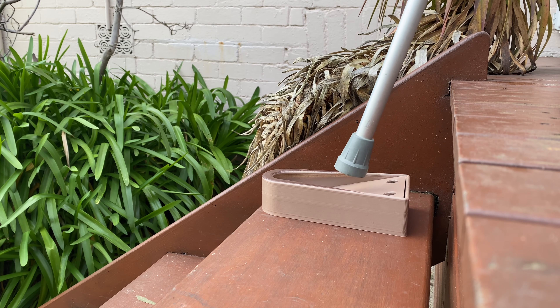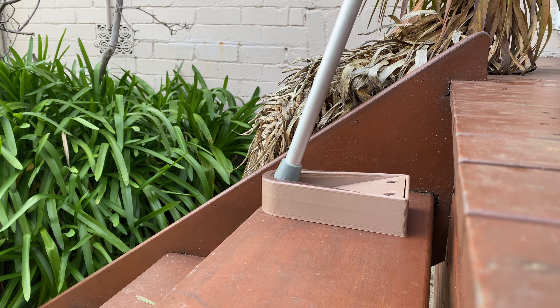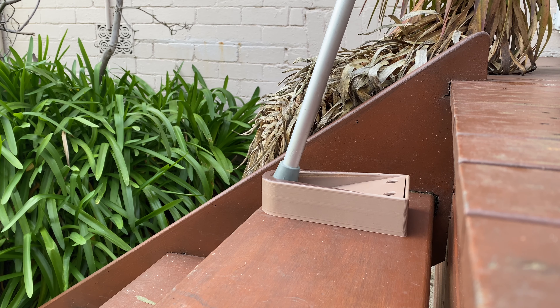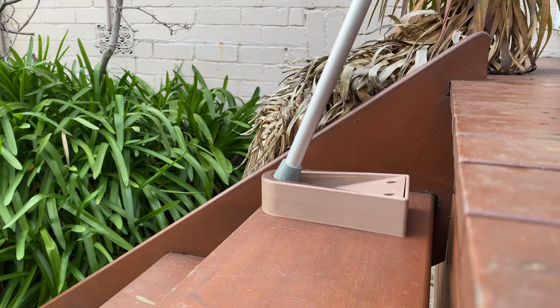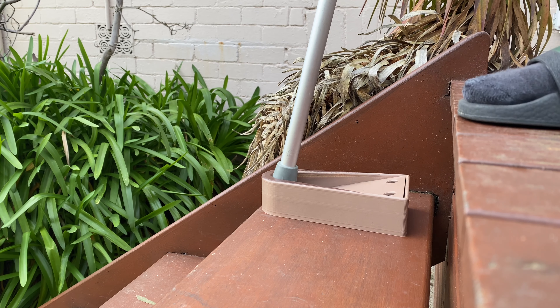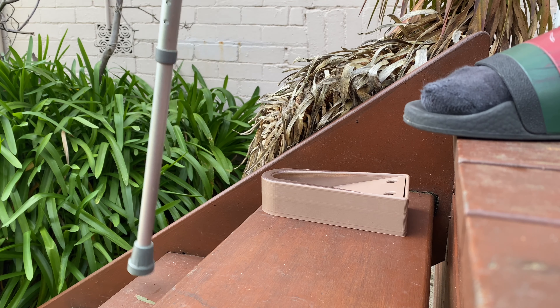With the ramp inside and the device in place, the user is able to descend and just aim for the ramp, slide on down, and the nice glossy surface lets it slide in. It'll just lock in place at the end, held under the lip, and the user is able to put all of their weight into it with no chance of it going anywhere. It's a nice secure point, and then after stepping down it's just a simple back outwards and down onto the next step.